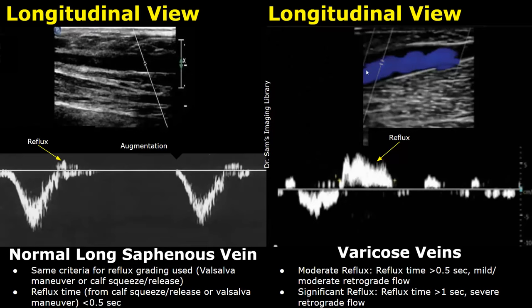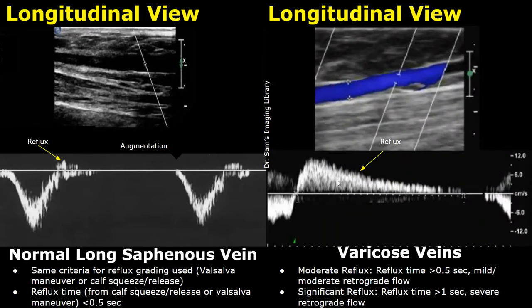Here the color is blue. When the color is blue, the flow in the spectral waveform is often seen below the baseline. Blue color indicates that the flow is moving away from the ultrasound probe, which is why it appears below the baseline. But if there is reflux, the blood will move in the opposite direction — towards the probe — and that is why the reflux will be seen above the baseline. This is due to Doppler angle and the position of the probe. The duration of reflux in this image is much larger, and this could be a reflux duration of 3 to 4 seconds — that is a significant reflux.